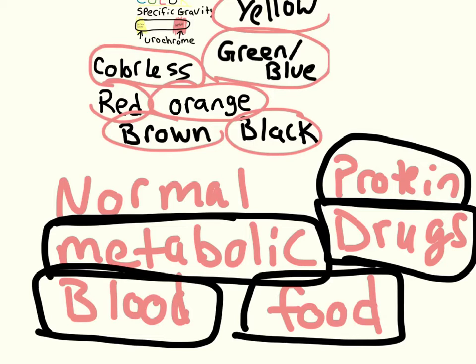In fact, it's in my study guide if you ever need to reference it, but I actually would point you to Campbell Walsh Urology 10th edition. It has an almost exhaustive list of colors and what they mean. But because yellow can mean like 3 or 4 different things, none of these things are going to be specific or sensitive. They're just going to lead you in the right direction. They're going to give you more direction on where to look.